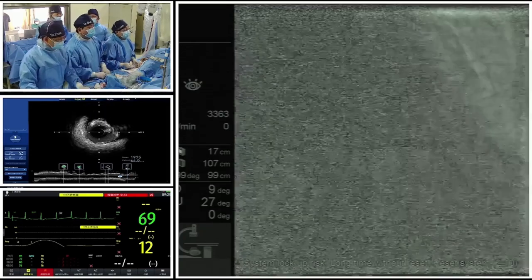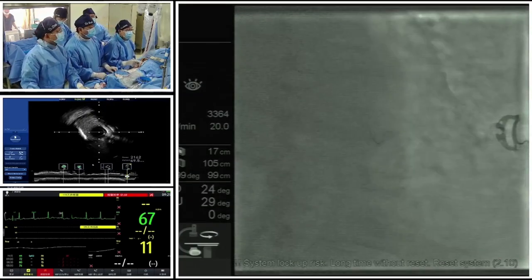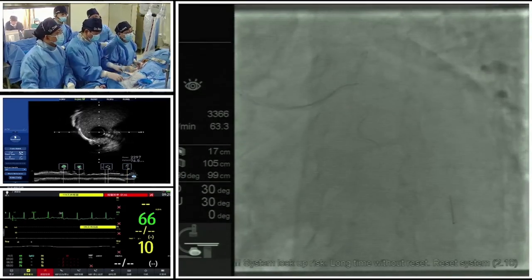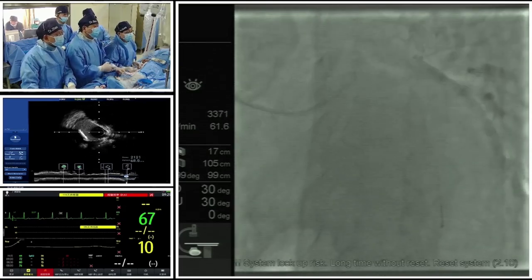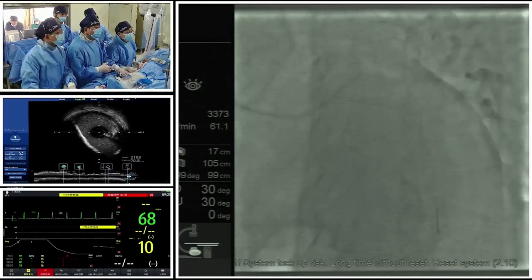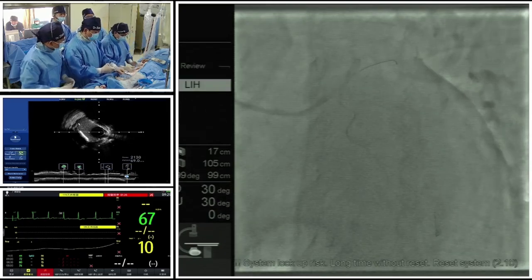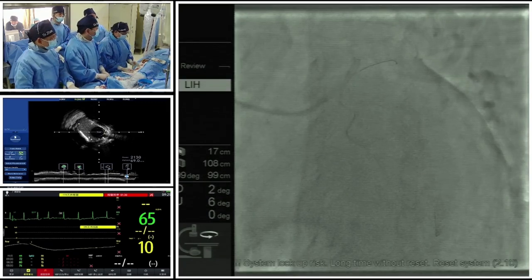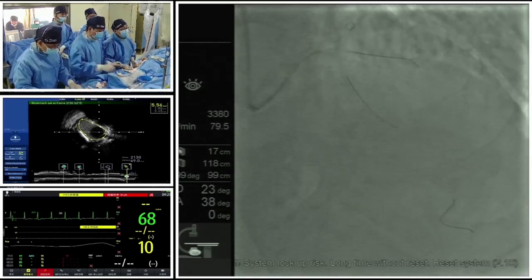Dr. Zhang, Dr. Gong actually did the pressure microcatheter FFR to confirm the results of the QFR. As I mentioned earlier, this is a very new technique, invented by a Chinese doctor. So what's the advantage of this new technique compared with the pressure wire? Oh yes, the microcatheter-based FFR device was totally invented by our domestic scientists.